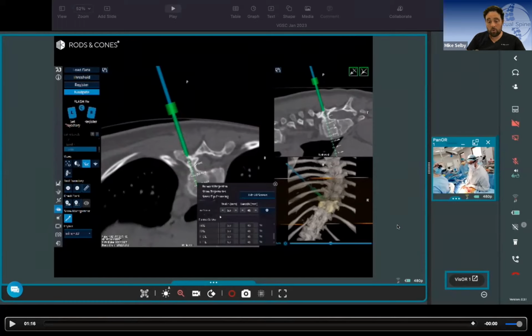So I often instrument those, or do the cannula run first down those, and then bone wax the hole, maybe pop a wire in it, and then do the screws at the level above and then come back and put the screws in that. It's just about working around the clamp, little workflow things. But in a very stiff, say, ankylosed thoracic spine, where it's quite flat or in one plane, you could do 4 segments at a time very easily. I have found after about 4 segments, it starts to lose accuracy. But because the re-registration is so quick, you don't need to worry about having huge long segments when you do it.